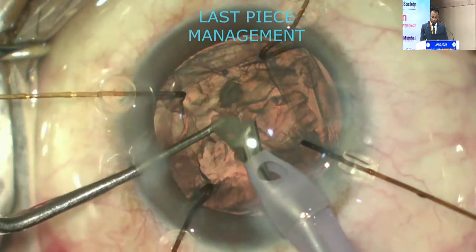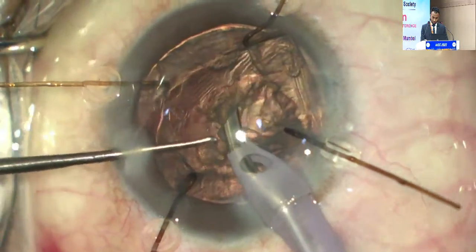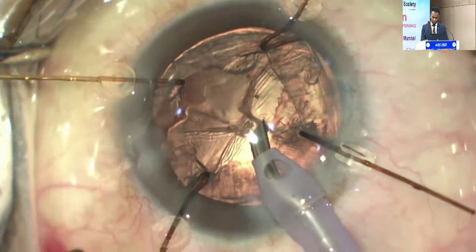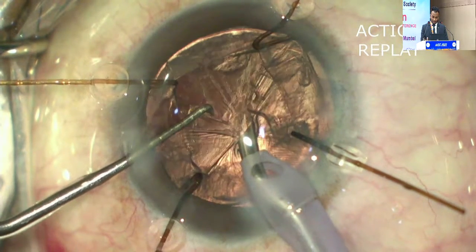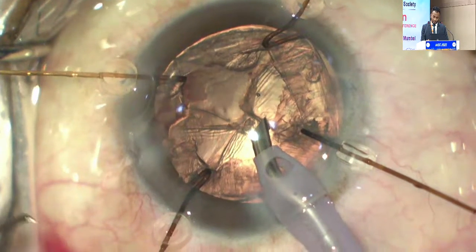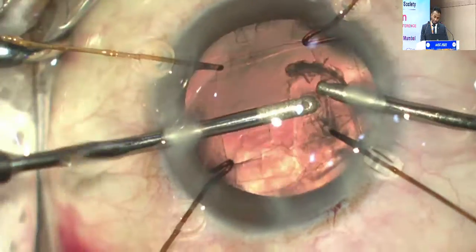Even with lower, now this is the last piece. I just thought I was relaxed and done, and just see what happens now. Okay, the PC just caught. I'll just show it in slow motion again. Use timely reflux and let it back. Take your time, put your cohesive viscoelastics. There's no PC rent, it just had caught and I have let it back in time.